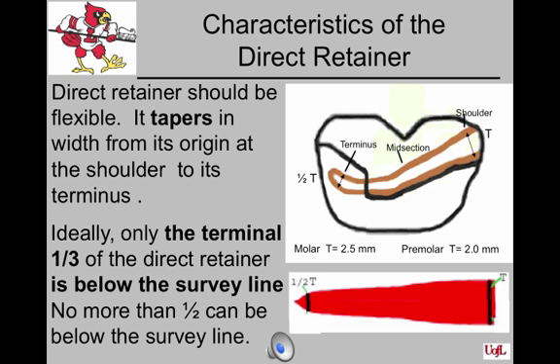The retentive terminus for a suprabulge clasp should terminate at the mesial or distal line angle of the corresponding abutment tooth at the opposite end from its origin. It should ideally be placed on the facial surface of the abutment if the appropriate contours are present or can be made to be present by tooth alteration. The terminus is ideally placed in the cervical one-third of the tooth occlusogingivally, but no higher than the middle third.